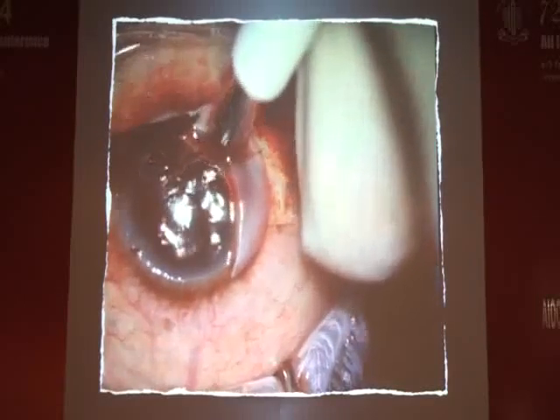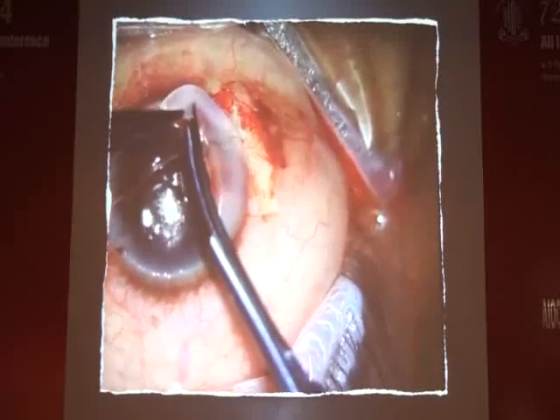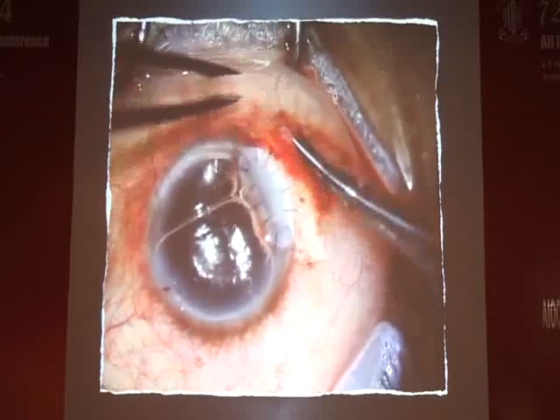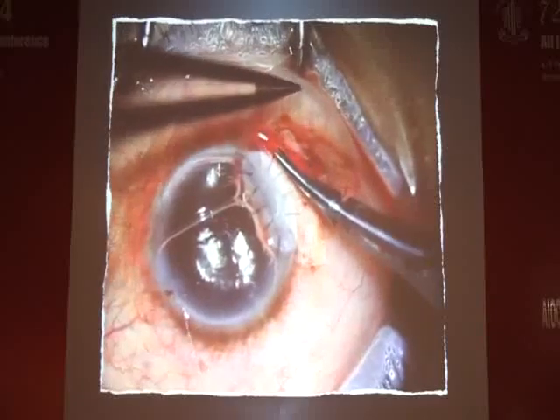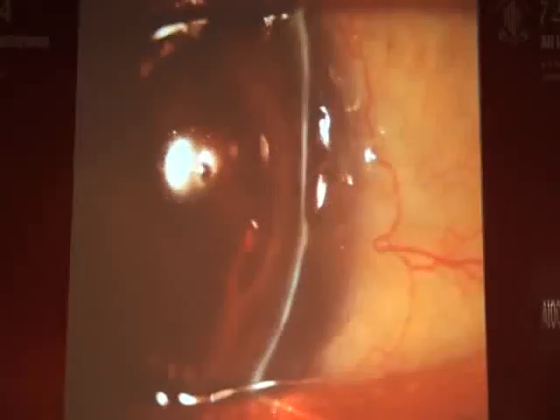And basically there's some science to this, but you have to make it up as you go along. And in each case it's slightly different. So it's not like a completely refined cut wound where everything is matched perfectly, as with the femtosecond. So you can use this in a variety of situations, the same basic principles.